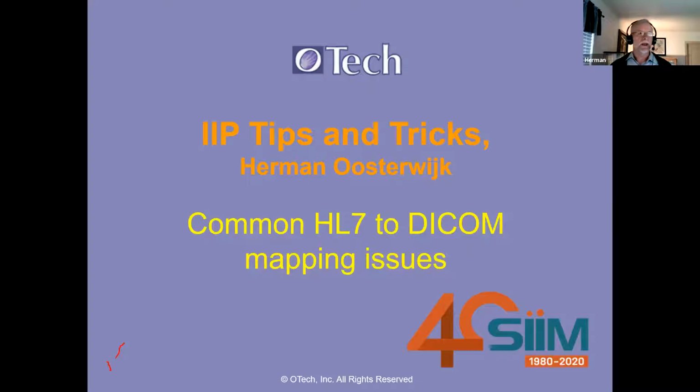So, common HL7 to DICOM mapping issues. What's kind of interesting is that when I talk at IIP, there's not a lot of knowledge about HL7. I was just talking with a PACS administrator yesterday. They had some problems because the worklist didn't show up. And we found out, okay, it looks like the modality field is empty. So I said, well, sure, why don't we take this HL7 order message, open it in Notepad, and fill in the modality field, OT, and then see what happens. And of course, perfectly, the worklist showed up. And then I asked, so do you ever look at HL7? He said, no, I really don't.